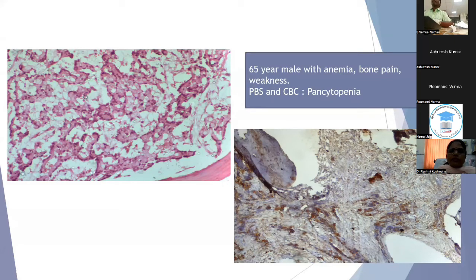So bone marrow metastasis is quite common, and we get certain evidence in the peripheral smear, like the presence of teardrop cells and nucleated RBCs, and these patients can have pancytopenia. We can see the infiltration in the aspirate smear. And even if there is no infiltration seen on the aspirate smear, a biopsy is a must and must always be done if we are suspecting a metastasis.